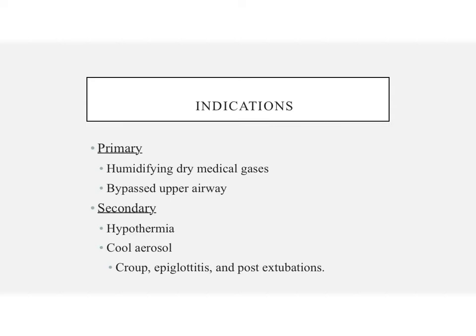By doing this, we are going to ensure that the normal function of the mucociliary tract is there. We're going to make sure that patients are able to cough up and move their secretions. We're going to make sure that they're not mucus plugging. So the goal of humidification therapy is to maintain those normal physiological conditions in the lower airways.